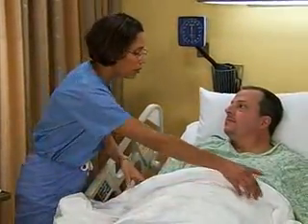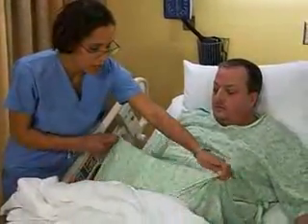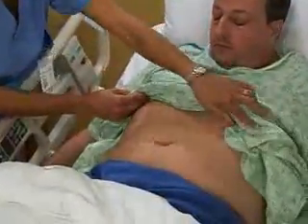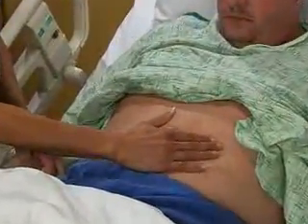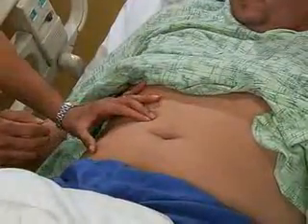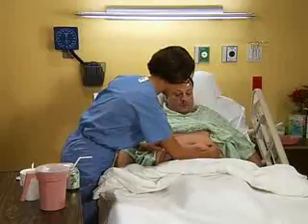Then inspect the site for bruises or inflammation and palpate it for masses, edema, and tenderness. Avoid sites with these abnormalities because they can affect drug absorption. To administer low molecular weight heparin, use a site on the right or left side of the abdomen at least 2 inches from the umbilicus.